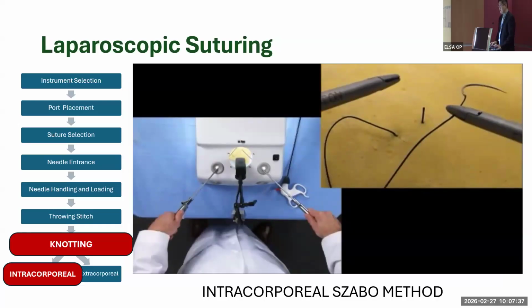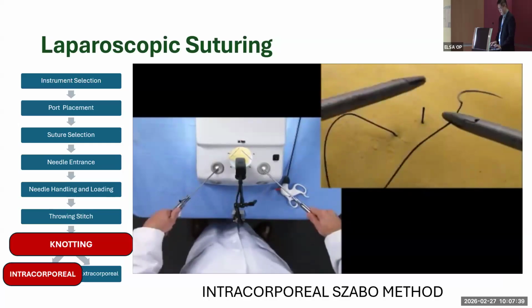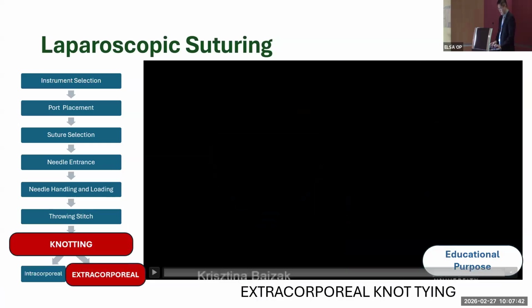Next, we proceed on with doing extracorporeal suturing. We now have another video to show you how to do extracorporeal knot tying.